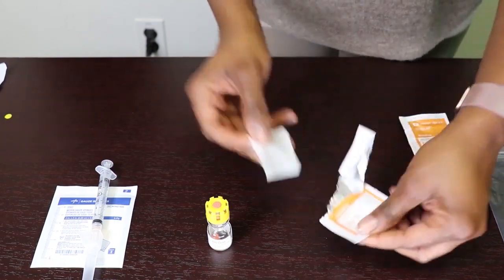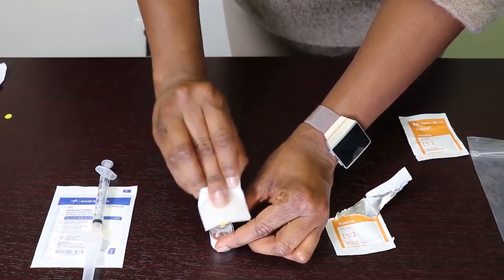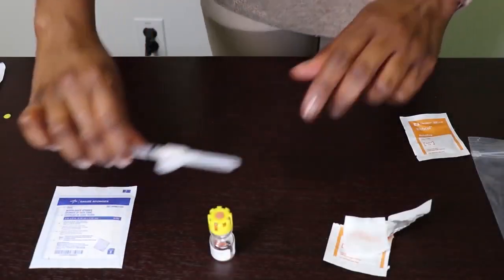If you have alcohol available, clean the top of the medication vial. Take the cap off the needle and insert the needle into the medication vial.